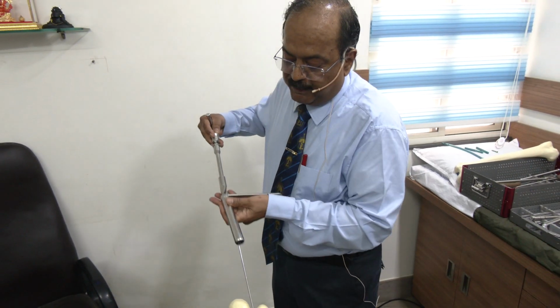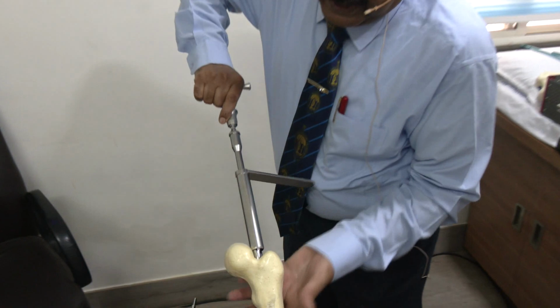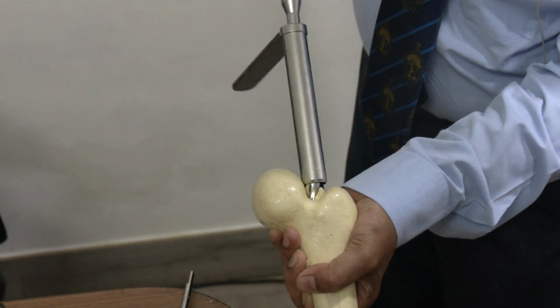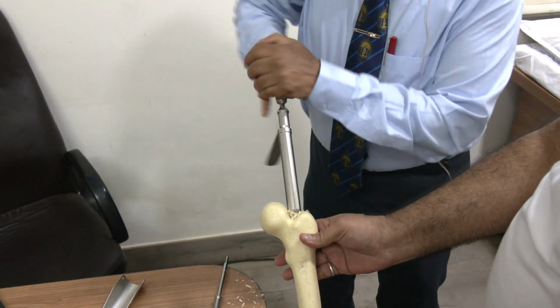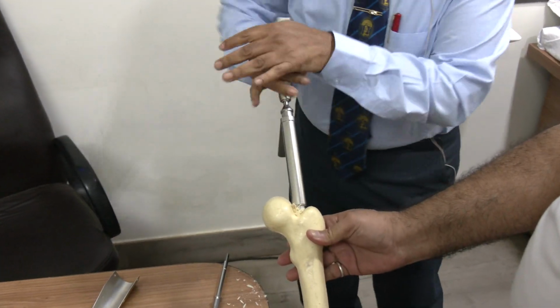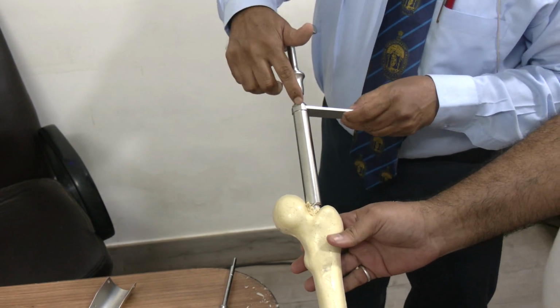So I am passing the protector sleeve first. Over the protector sleeve, I am enlarging. Again, you can see that in the majority of the cases, just with hand, you can do this surgery. Whatever I am using the brute force, that force is not required. Now you can see this has touched.